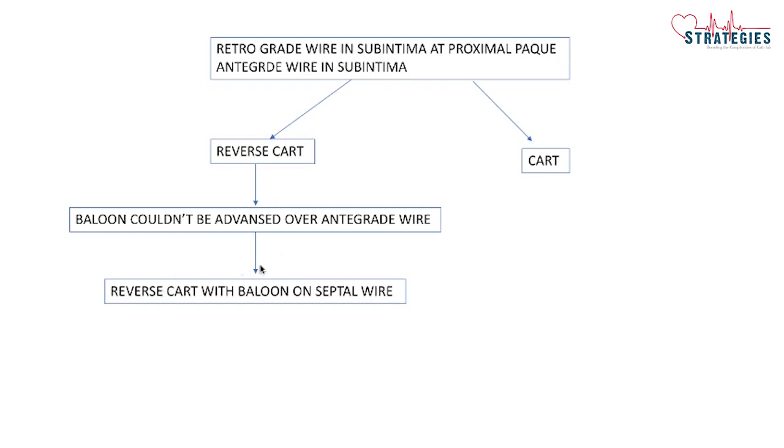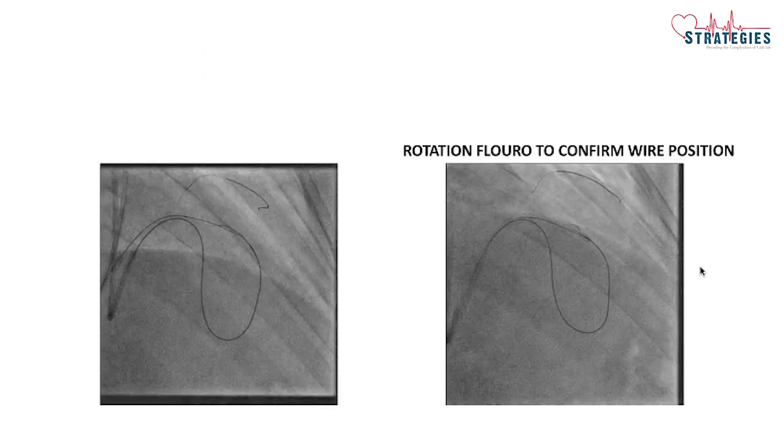So then I decided to do a reverse CART with the balloon on the septal wire. If I failed in doing so, the backup was to do CART.